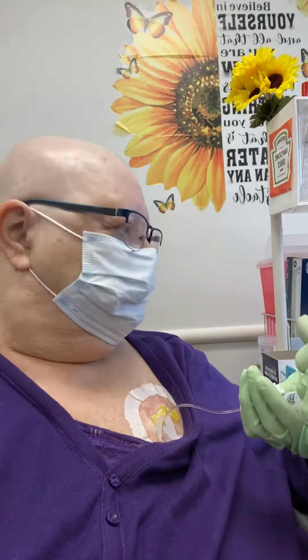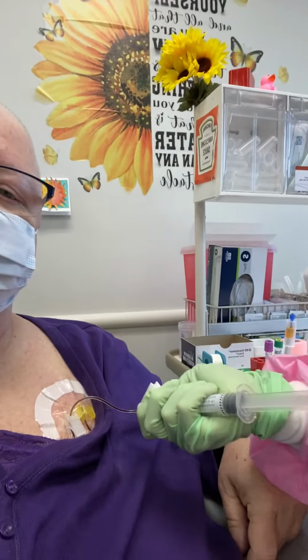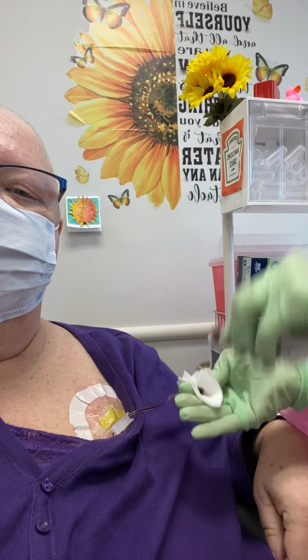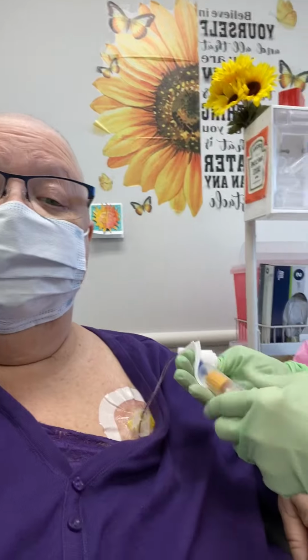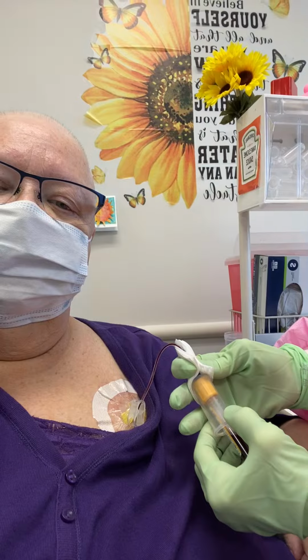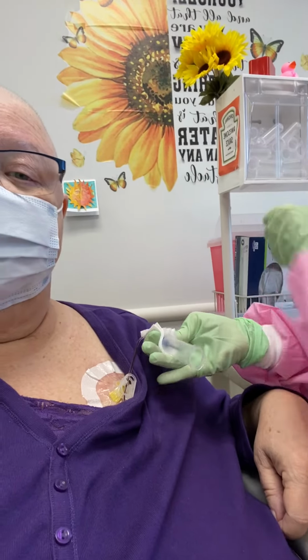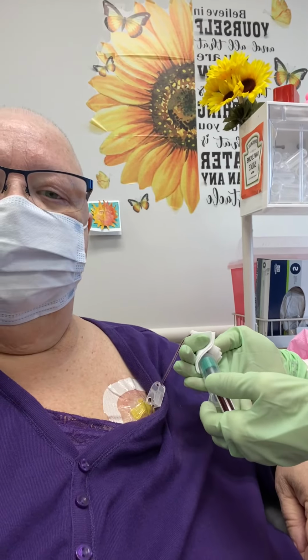And then she's going to fill 2 vials with blood. 3. Oh, 3. I always thought that, and then I started reading this for Compass Oncology, and it said, no chocolate. Taking out the diluted blood. Here comes the good stuff. So I guess the first vial was diluted. I didn't see you put saline in. Oh, you flushed it. See, she's fast. I didn't even notice. She put saline in first. That's why it was diluted. That's something new that I hear right now. And then 2 vials of full blood. All right. Ready to go?